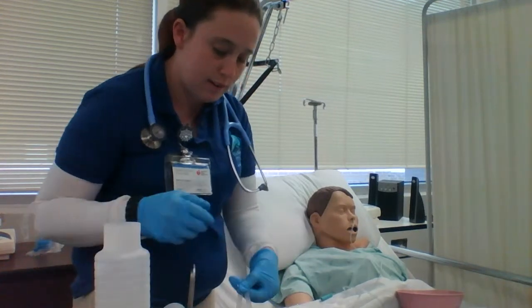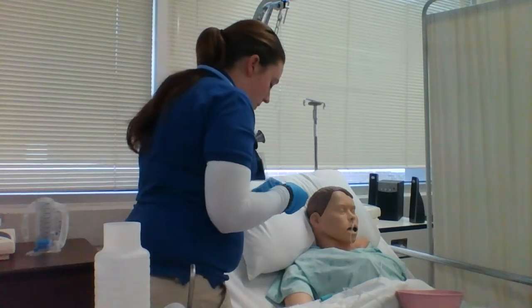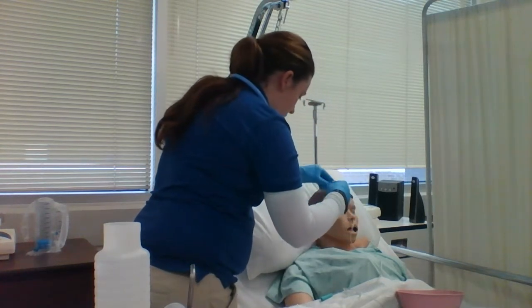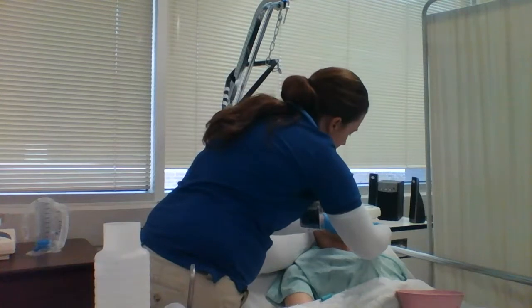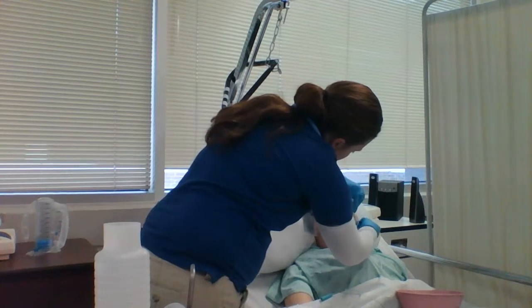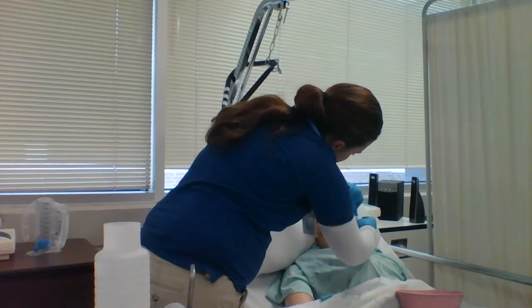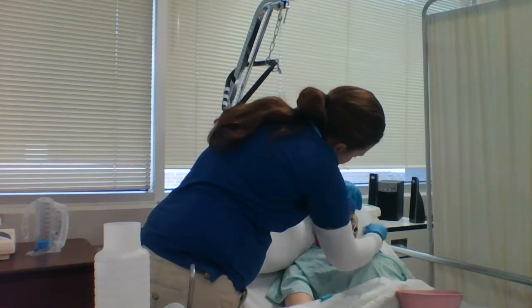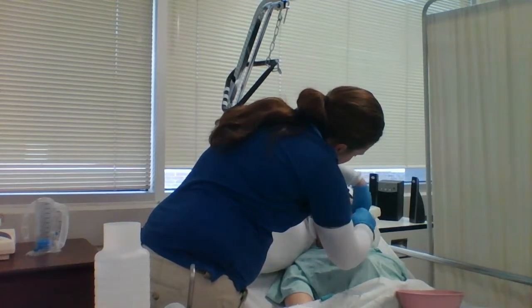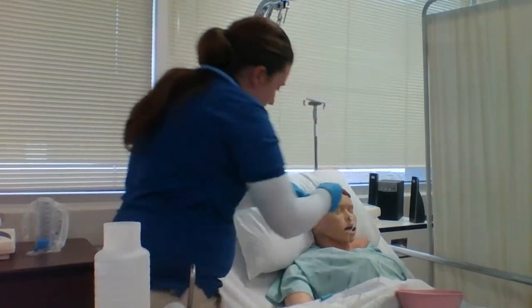Okay, now since verification is good, we're going to go ahead and tape it. Take one over the bridge of the nose.